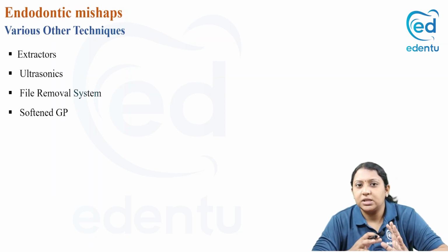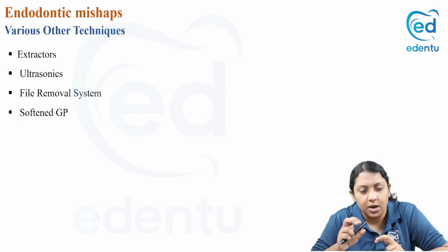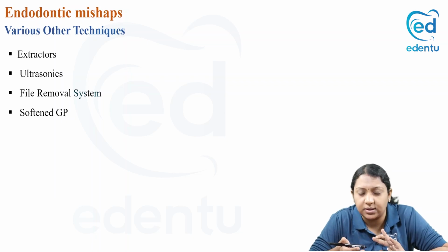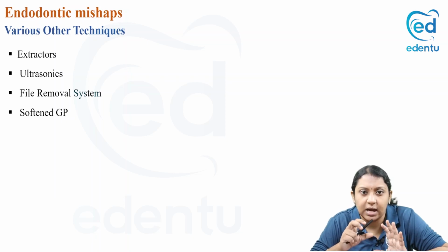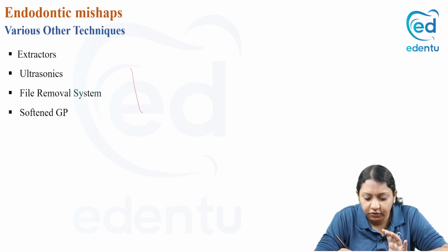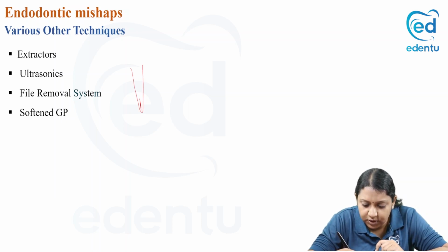So for all the above mentioned, the braided files and the kits available, the Masserann kit, post removal system, canal finders, endo extractors, we have to first use ultrasonics. We have to make a platform for all these instruments to engage on, because if it is a narrow canal, we don't have access to this part of the instrument.